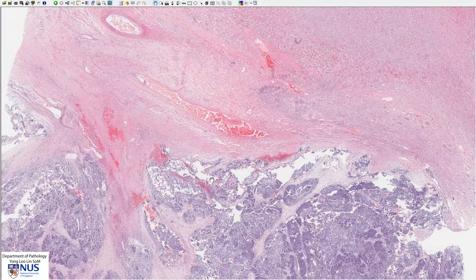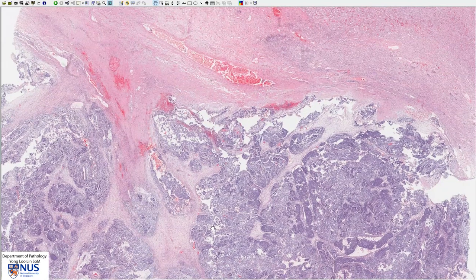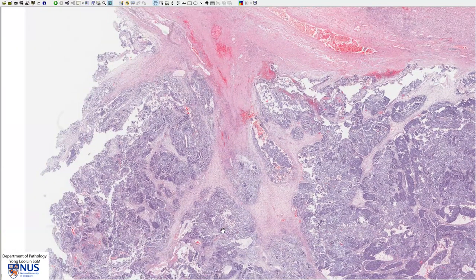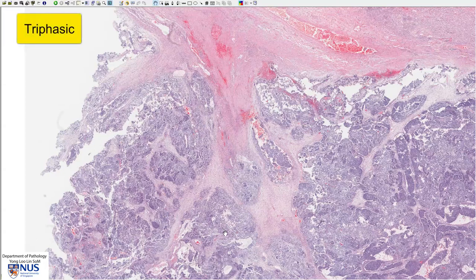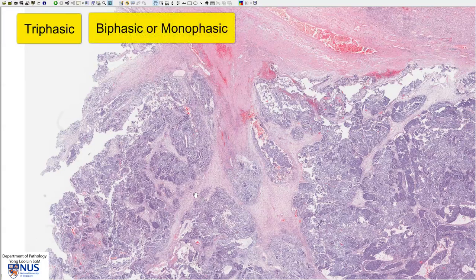Moving back to low magnification, we can see that this tumor is actually relatively well demarcated from the rest of the non-neoplastic kidney. Nevertheless, it is a malignant tumor. Wilms tumors or nephroblastomas arise from embryonal kidney tissue, and hence they can have a variety of appearances. Usually the tumors are triphasic, meaning that there are three components. Sometimes, less commonly, they can be mono or biphasic, with one or two components respectively.